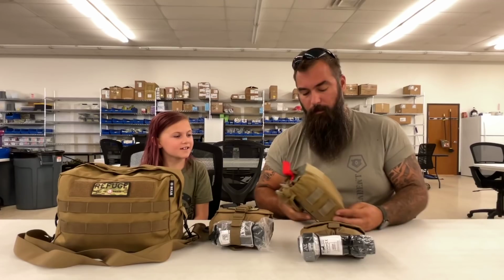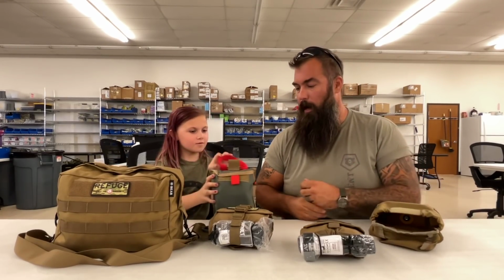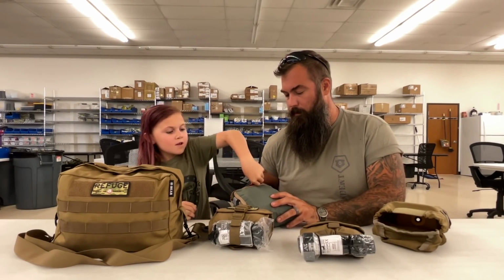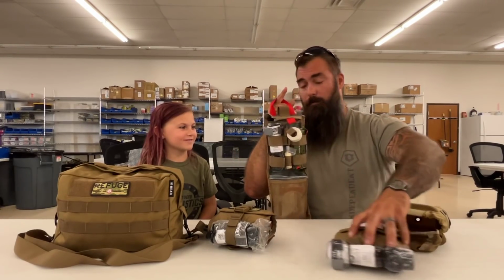So you rip this open. Here, pull that red handle. Yank on it. There you go. Now, see this right here? This little red tab? Yeah. Pull that red tab. You are good at this, right? I'm strong. You are strong.